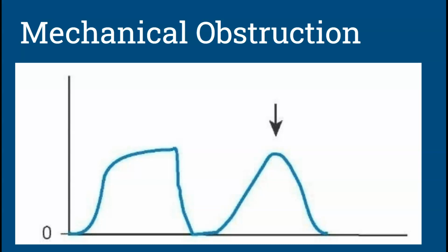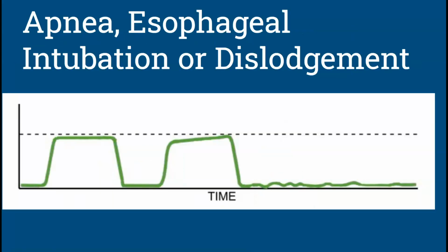When we were talking before about how you can tell if it is in fact a foreign body airway, you would get something that looks like this, kind of peaked in, quick out. There's no gradual line like here. There's some sort of obstruction right here, and that causes this kind of mountain shape. If you forget to ventilate your patient who you now sedated and done a great job, you'll end up with this flat line, right?